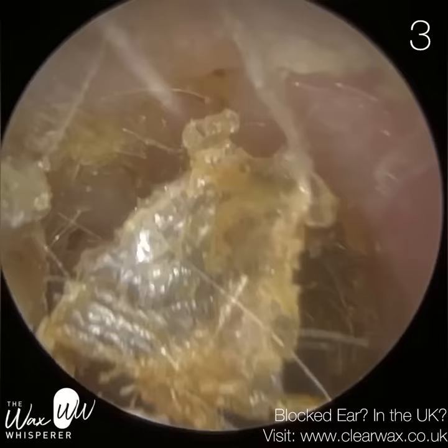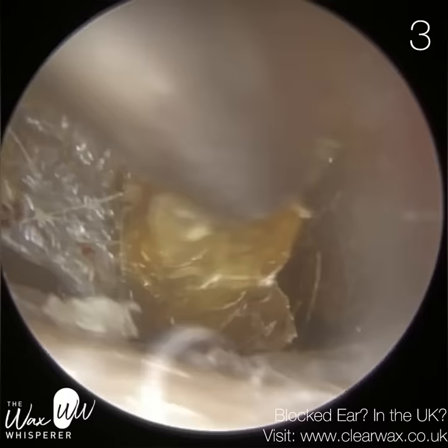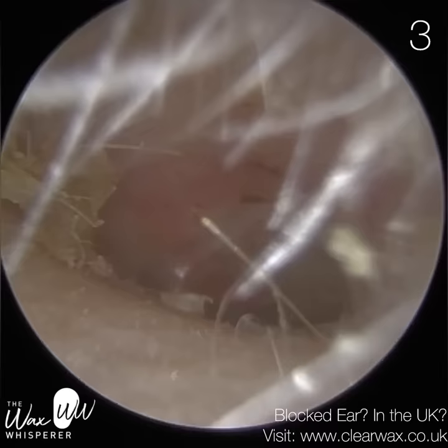This is patient three — quite an interesting one. This patient attended with really crusted, dead skin. It's not earwax; this is the skin I was referring to earlier — it's failed to migrate and instead has collected and crusted on the surface of the ear canal. This patient has got what we call a subtotal perforation — a huge perforation. You can see the middle ear bones: the incus and the stapes, also known as the ossicular chain, and one is missing.